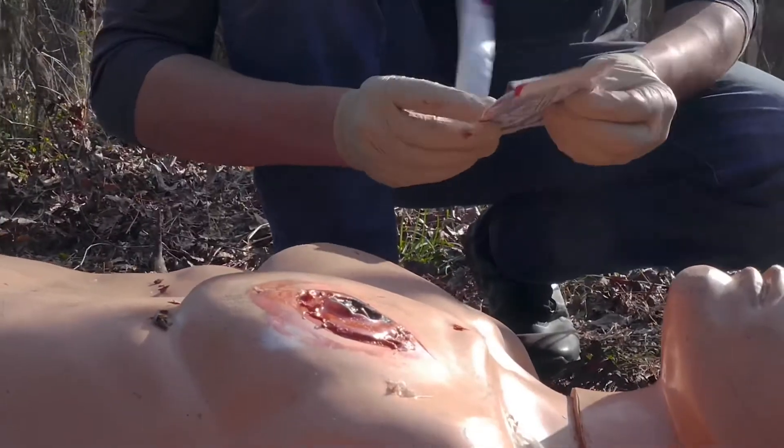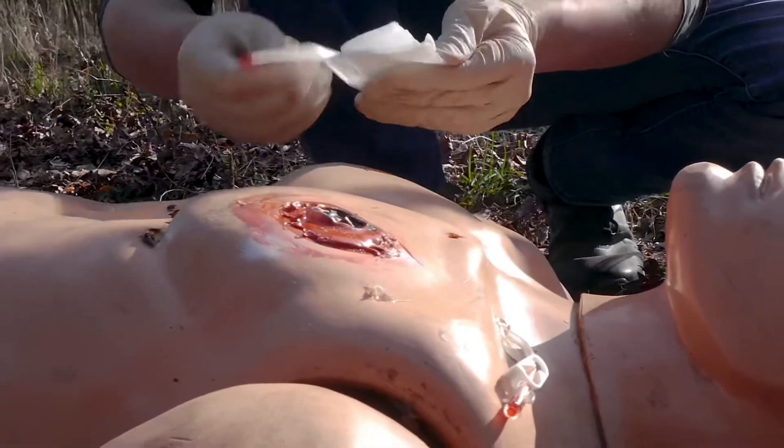If we find any penetrating trauma, holes, or what we would call a sucking chest wound, we want to place a gloved hand over that. Our immediate fix is an occlusive dressing, but immediately we want to place a gloved hand over it to create a seal to that chest cavity. Once we have the gloved hand in place, we get our occlusive dressing ready.